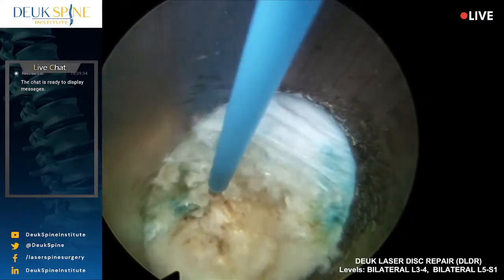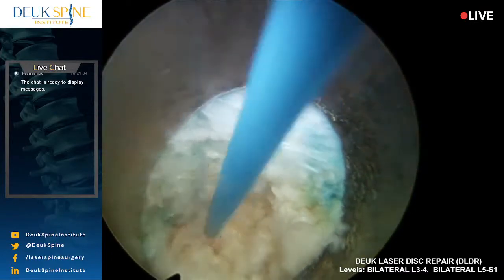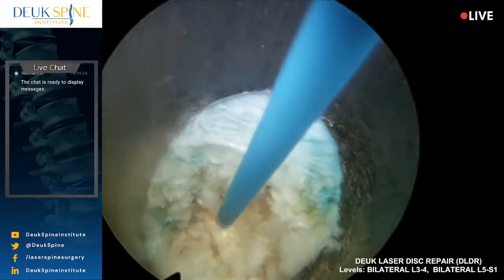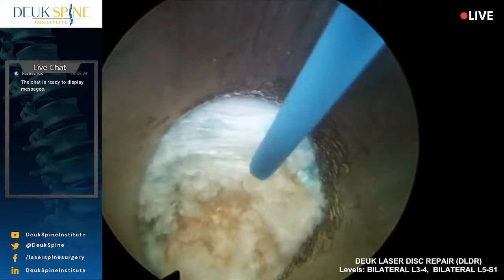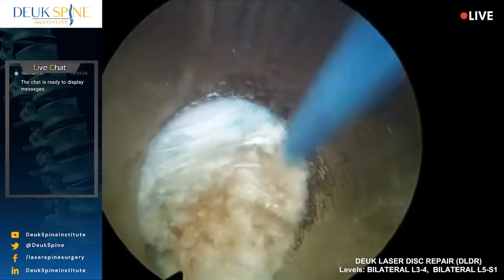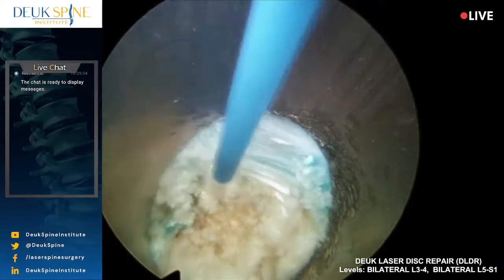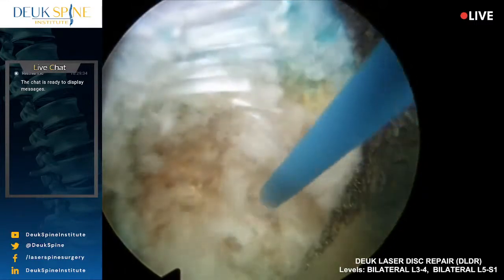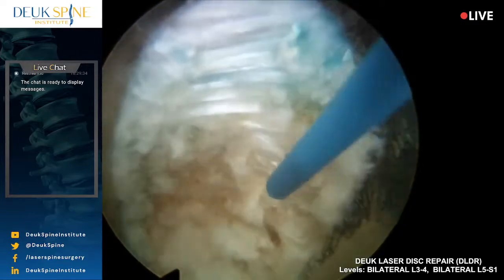There are some areas like here where you see the white and the yellow. It's all calcium deposits in the tissue. It's kind of an interesting, almost like a hypertrophic scar type picture. The scar being the annular tear, hypertrophic meaning an exuberance of collagen, but not super thick collagen.